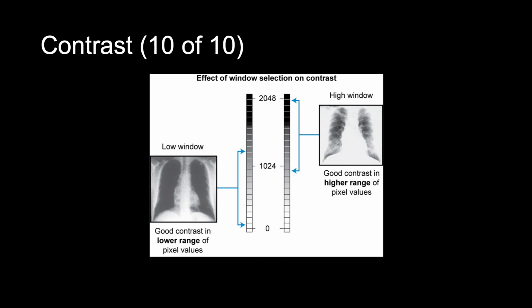So this will need to be window leveled and window width adjusted, and you can go corner to corner to do that.